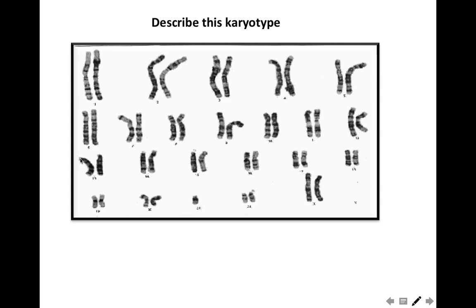ادي chromosome 13، ادي السنترومير هنا والسنترومير هنا، يبقى this is an okay acrocentric chromosome. نيجي هنا على chromosome 14، ادي السنترومير هنا، there is nothing above the centromere or the satellite، فبالتالي this chromosome is okay. Let's look at this chromosome. Well, it should end here.